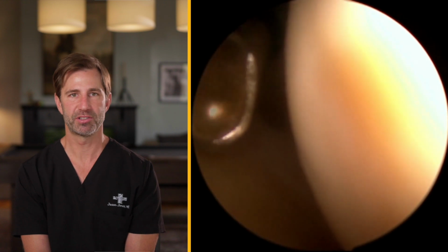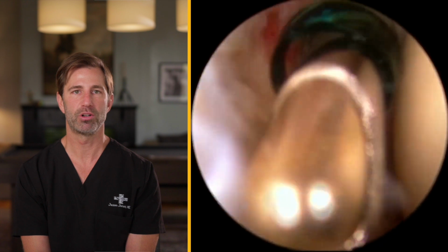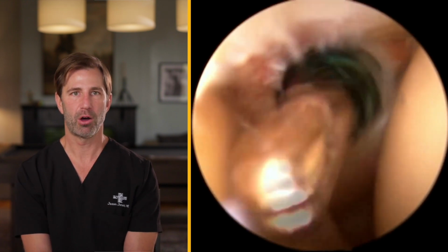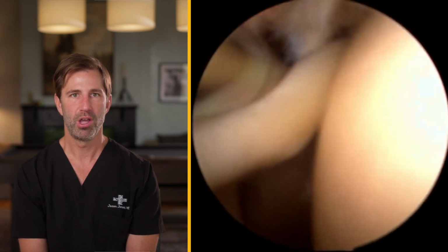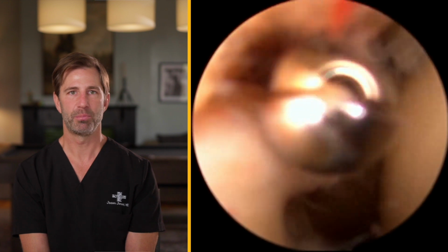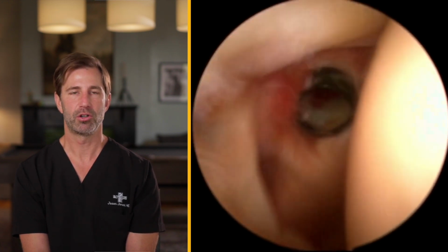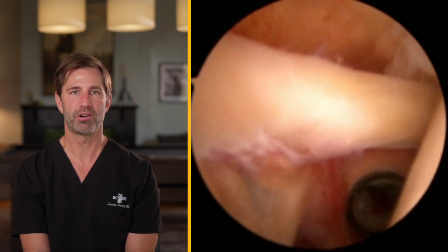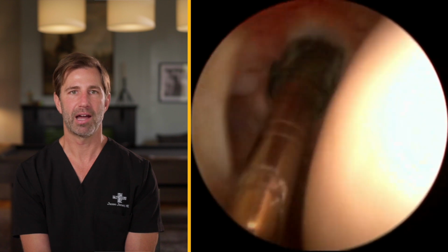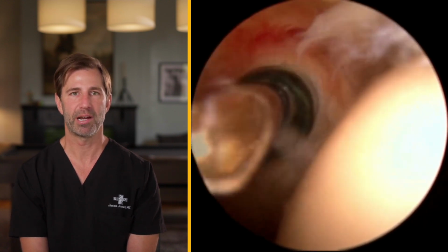The first thing that I'll do is establish a posterior portal. What that means is I'll create an incision in the back of the shoulder in order to place a camera inside the shoulder itself. Once I'm in the shoulder, I'll then establish an anterior portal. That is my working portal. A portal in this case refers to a small incision, which is roughly the size at the end of your finger. This allows me to insert instrumentation and sometimes devices in order to fix tendinous tears or bone damage. And this allows access to all sorts of equipment that we can use in arthroscopic surgery to repair your issue.